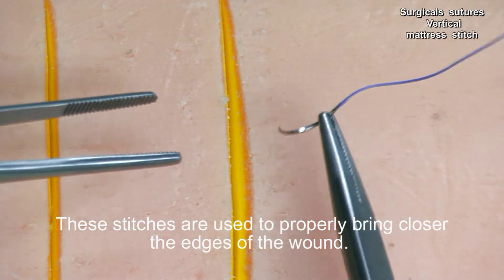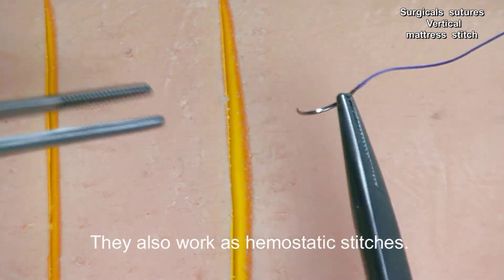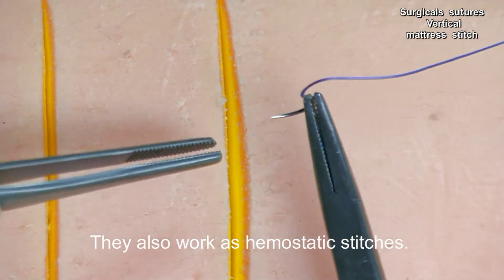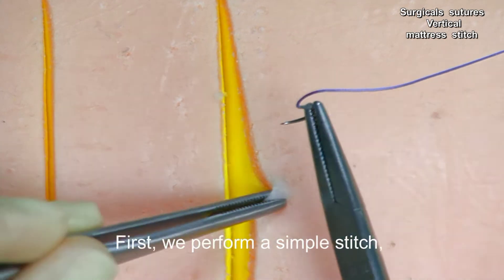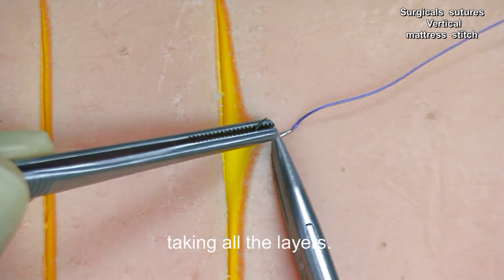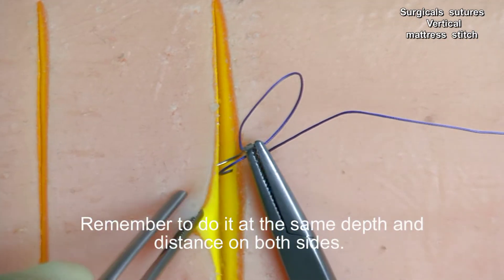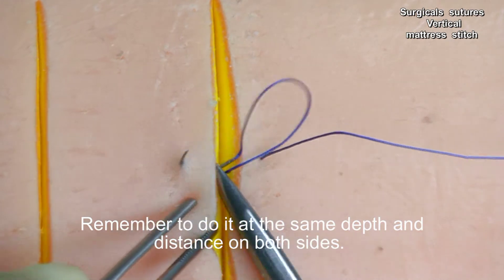These stitches are used to properly bring the edges of the wound closer together. They also work as hemostatic stitches. First, we perform a simple stitch taking all the layers. Remember to do it at the same depth and distance on both sides.